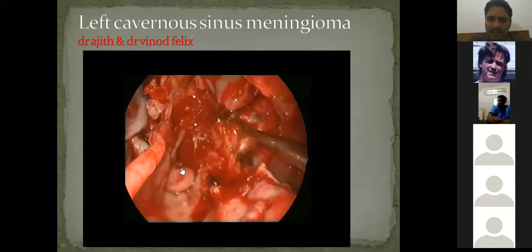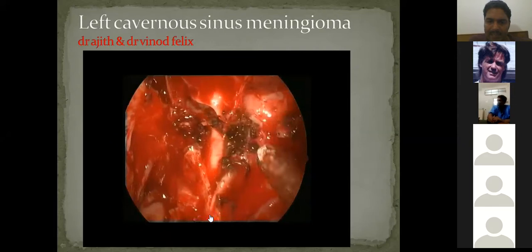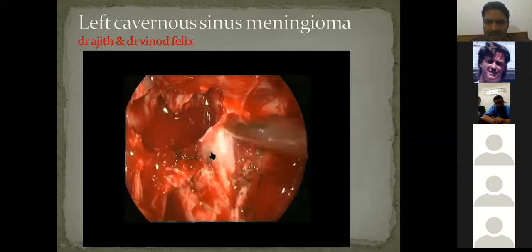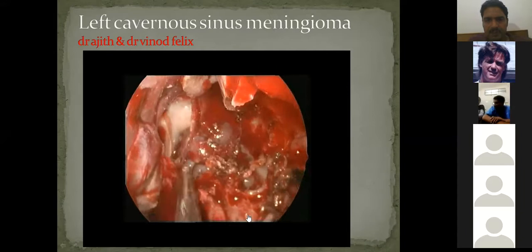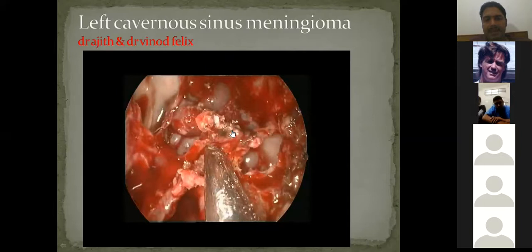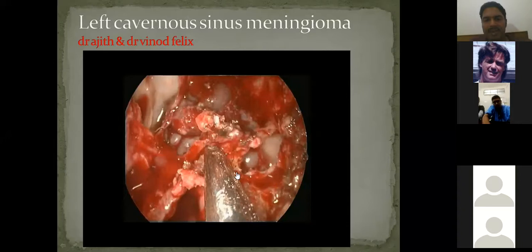And this is the greater palatine canal and the descending palatine artery here. That's the vidian nerve here, and that's the foramen rotundum. That's the keel of the sphenoid sinus being removed. So, to orient you, this is the sphenoid sinus, the vidian nerve, the foramen rotundum here. We are going to drill around this vidian nerve to identify the foramen lacerum.